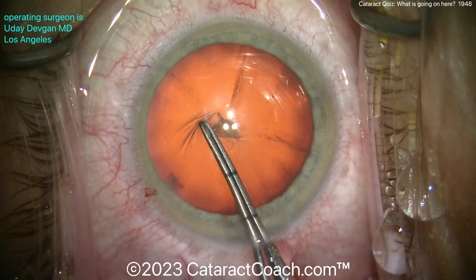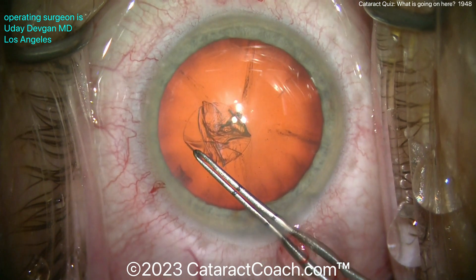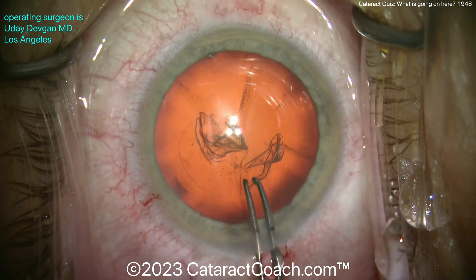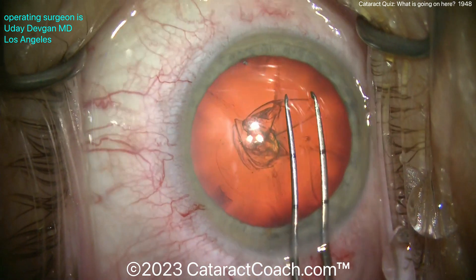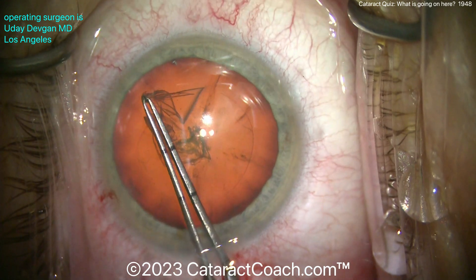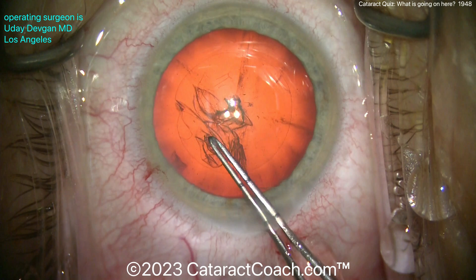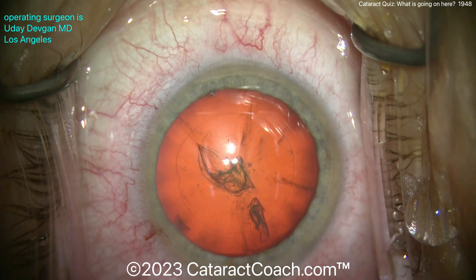As you poke in, there's a little bit of wrinkling of the lens capsule. Look at that — it's not so taut, so maybe there's a mild degree of zonular laxity. I want to create a nice five-and-a-half millimeter capsulorhexis. As I tear it, it looks like there's good support, but when I poked in with the forceps you saw a little bit of radial wrinkling of the capsule — that's kind of a hint. There it is, five and a half millimeters, done.